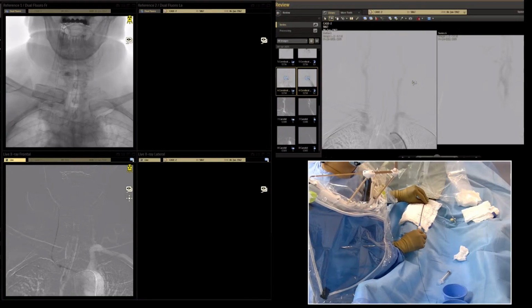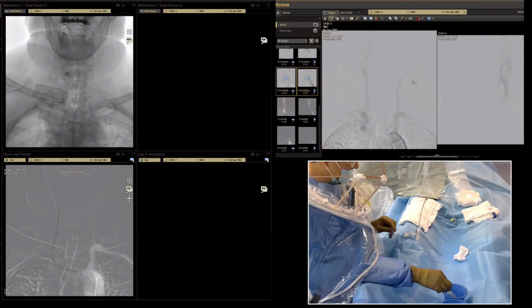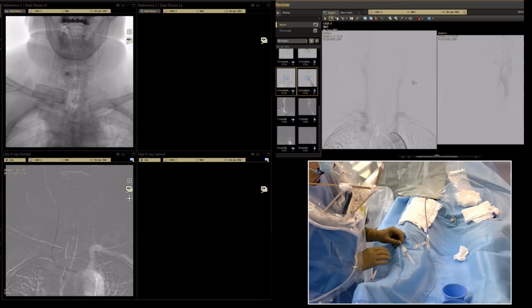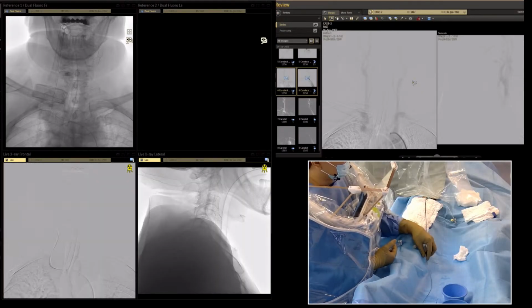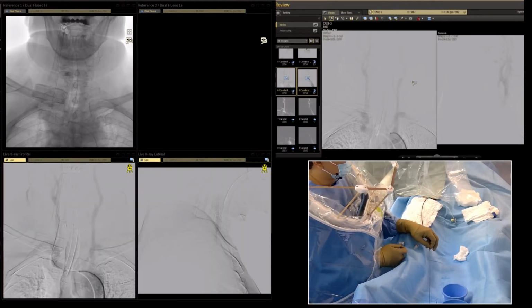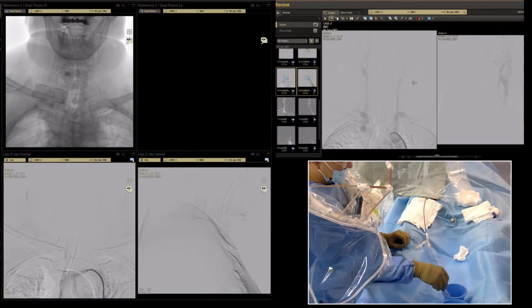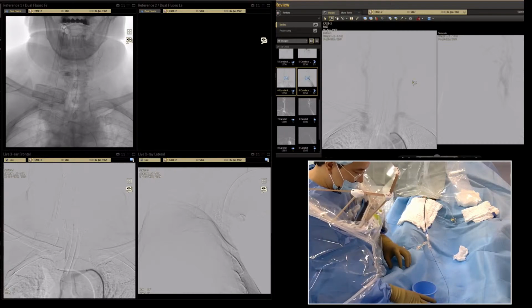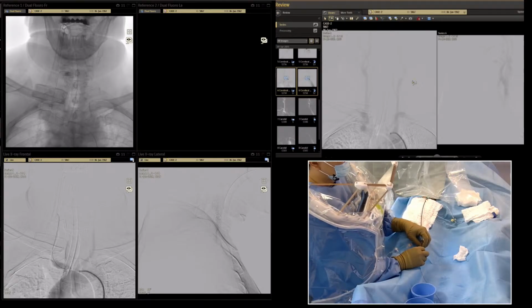Usually, if you have a problem in catheterization of the left ICA, it's better to take a diagnostic wire in the right brachiocephalic territory. Then we can do roadmap. Stop. Sure, please.